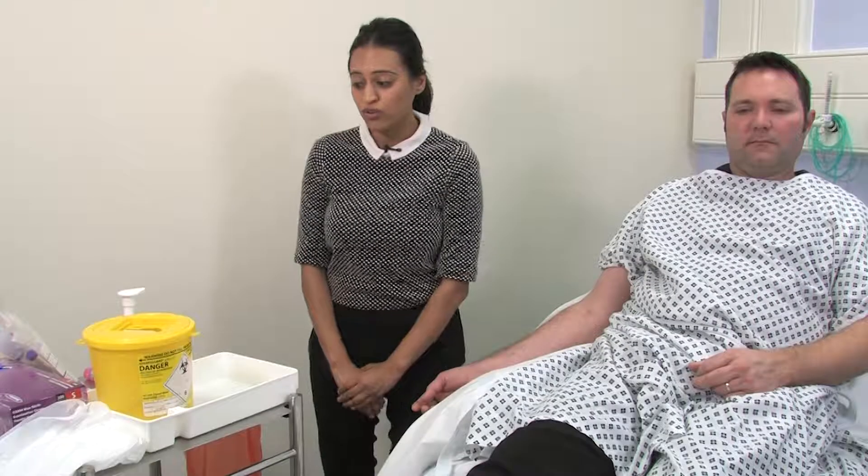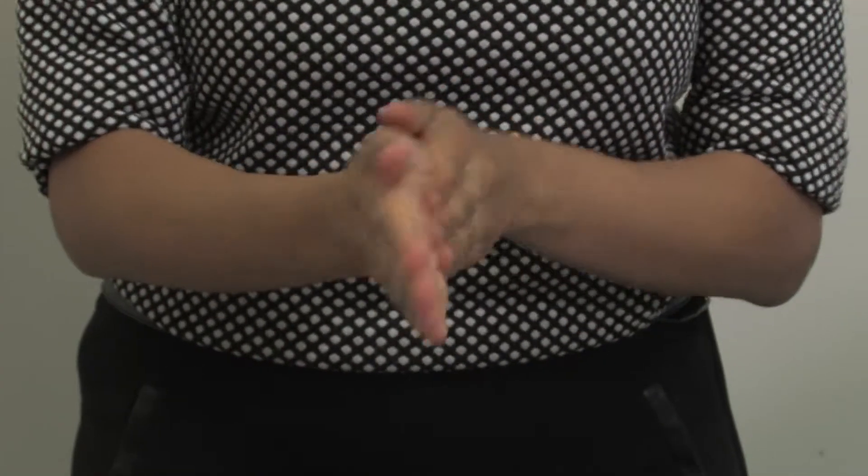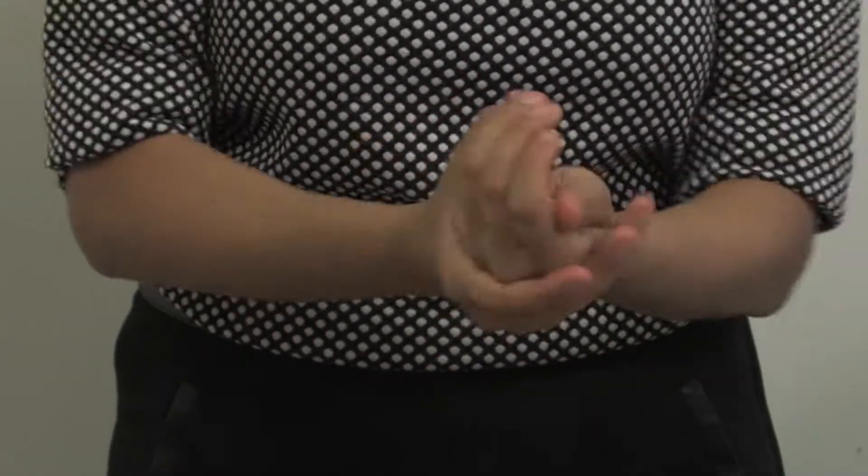The first step is to wash our hands. It's important that we use the seven step hand washing technique and that we use this technique every time we decontaminate our hands in the hospital setting.